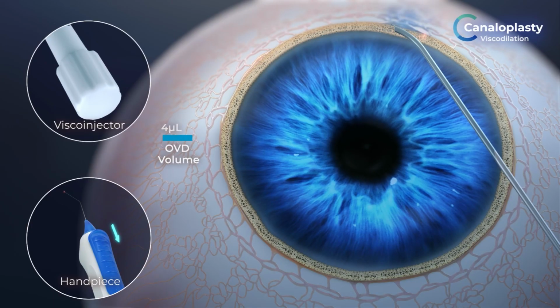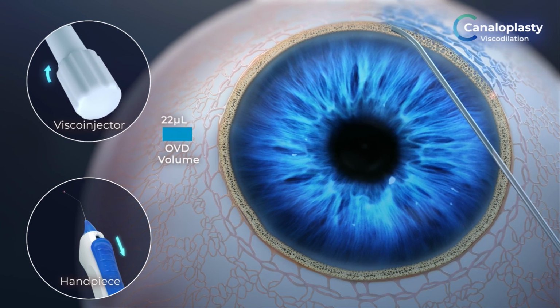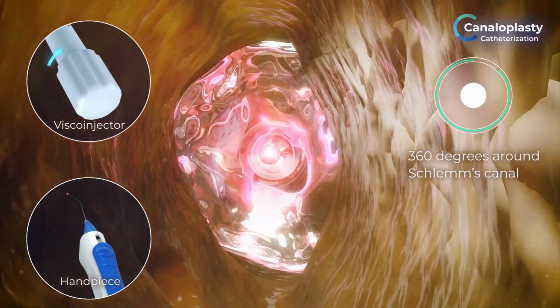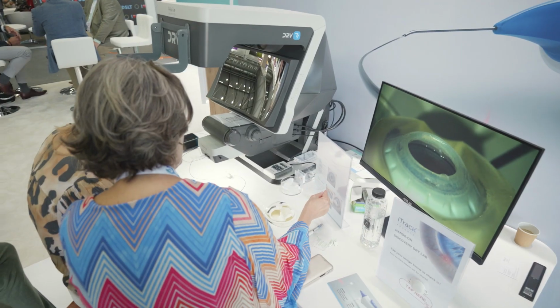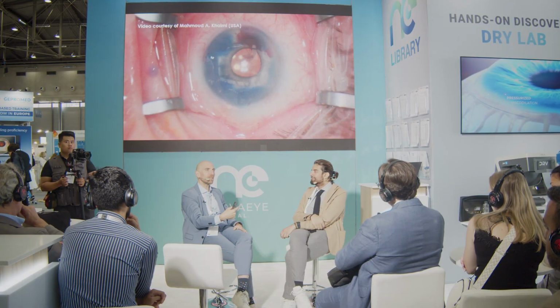It's the coordination with the assistant, because it's important that when you are injecting the viscoelastic, when you are dilating the canal, the assistant has to be coordinated with the surgeon to deliver the right amount of viscoelastic. You don't need a phenomenal surgeon to do it properly, but getting training, visiting people who do it regularly to get the tips and tricks, going to conferences, coming to booth talks, watching an interview, really getting the technique right is so crucial.